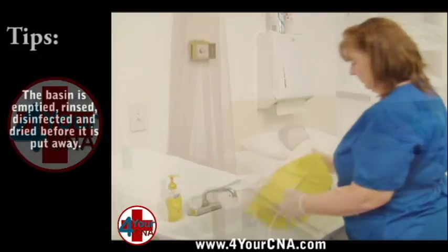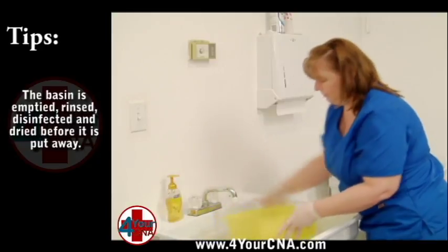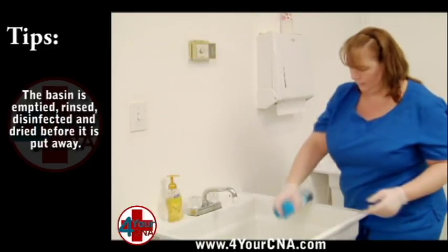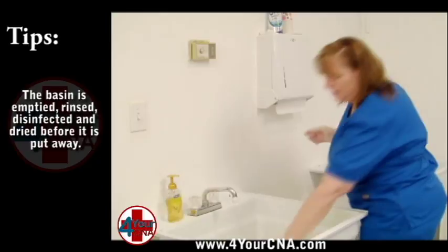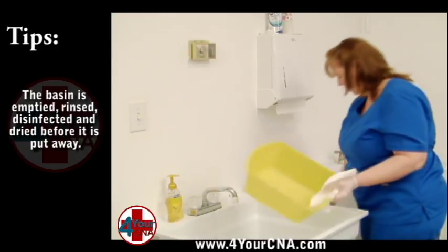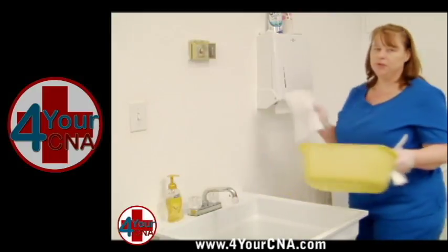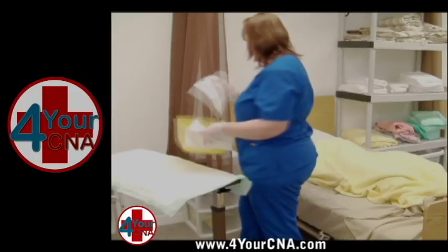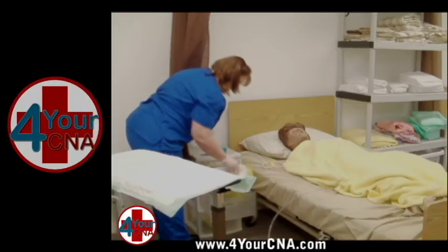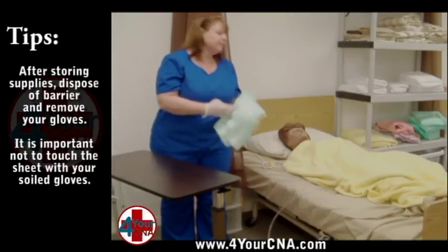Take the soiled basin to the sink to clean. Dump the water and rinse the basin. Turn off the water and set the basin down in the sink. Spray the basin with disinfectant spray. Use a paper towel to pick up the basin and dry the inside with a clean paper towel. Discard this paper towel. Dry the outside with a clean paper towel and discard. Get a paper towel to open the drawer. Pick up the soap on the way to the drawer and place it in the basin. Open the drawer with a paper towel and put the basin inside. Remove the barrier from the table and discard the barrier and the paper towels into the trash.